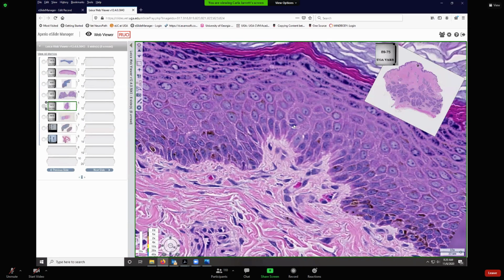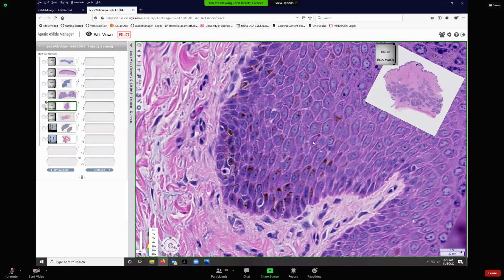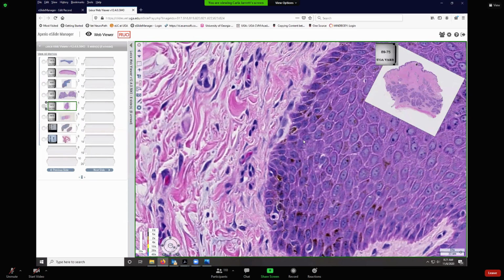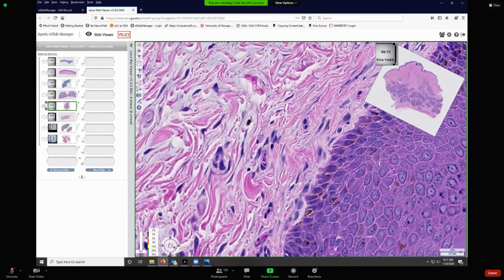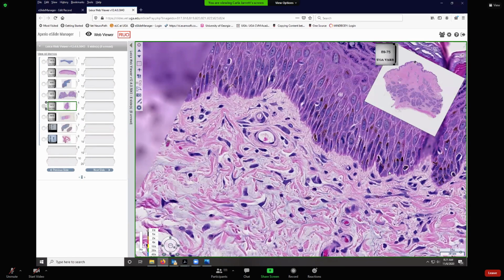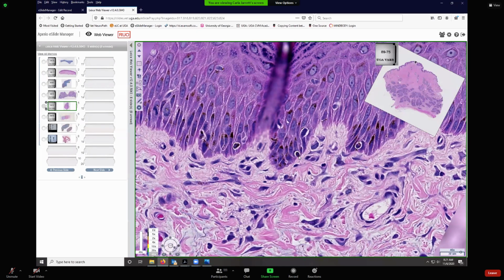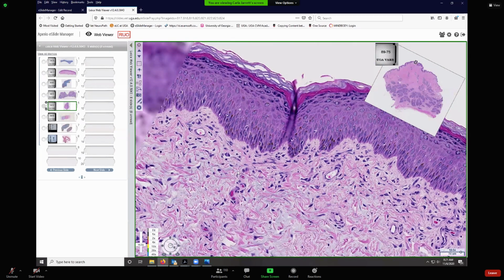So when you see shrink artifact in the different layers, like stratum spinosum, you might want to think, well, that could be a Langerhans cell there, or a macrophage. And then the tactile epithelial cells, again, hopefully they would be along the basement membrane. I like the shape of this one, but when I zoom in on it, it's got a little melanin associated with it, which makes me a little nervous that maybe I'm just looking at a bit of a melanocyte, but that gives you the idea of what it would look like. Okay, let's see.